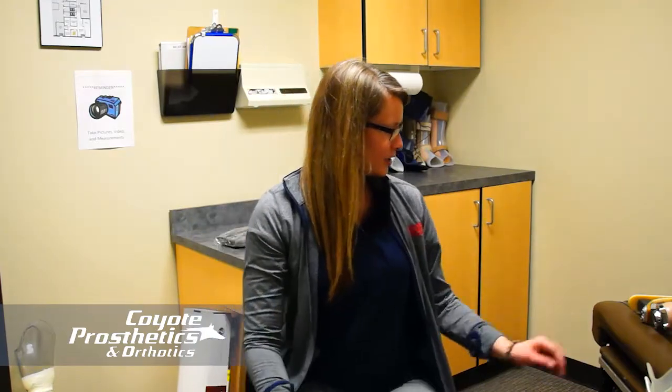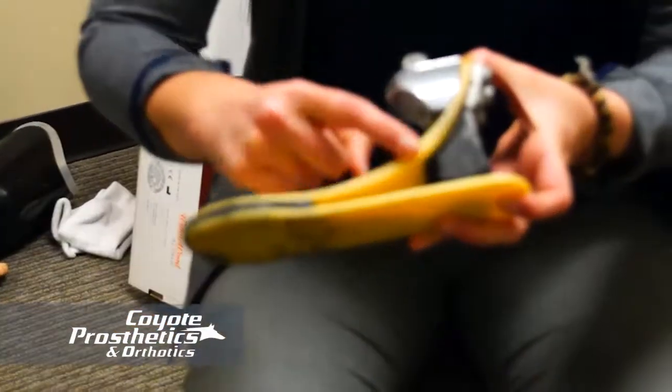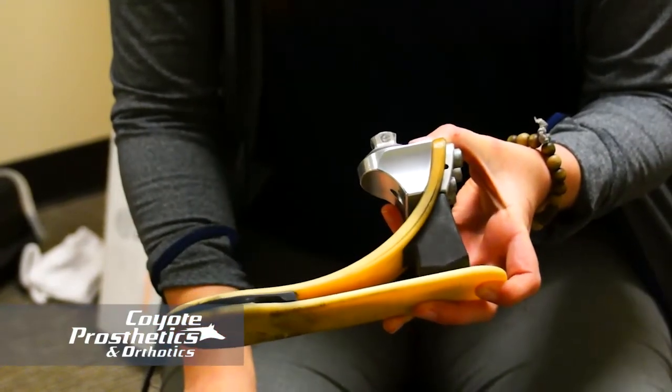These are all general guidelines. If you have been instructed otherwise by your doctor, care provider, prosthetist, or orthotist, those rules should override anything in this video. Generally, people don't have problems, but sometimes there can be mechanical failures. So if you hear a strange noise, if you see any cracks or anything like that, contact your prosthetic provider right away. And I can show you on here. This is an example of a foot that cracked a little bit, and you can see that in there. And she knew that right away, and she contacted us immediately so that we could repair or replace it for her.